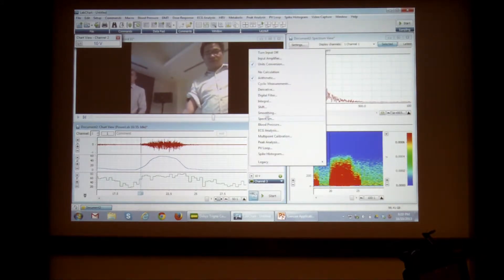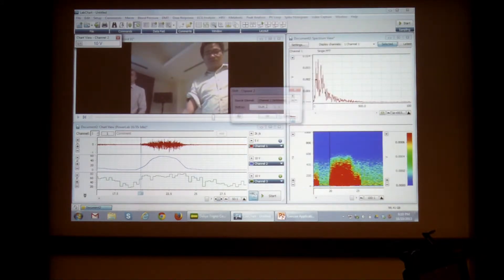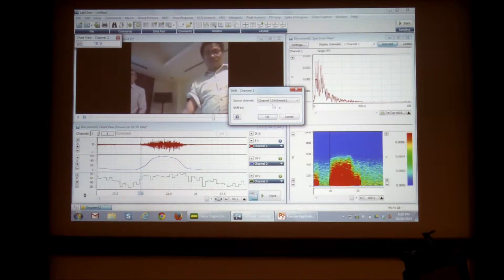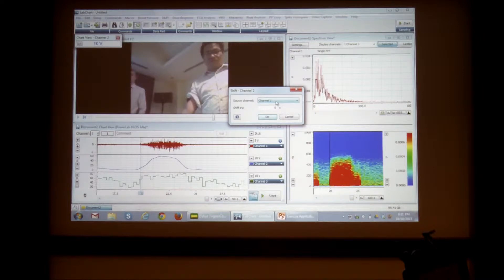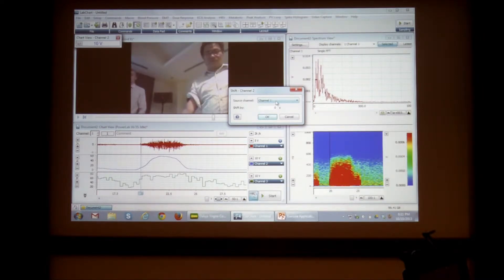And then you just use this shift function and shift the channel, so channel 1 by plus or minus point, so it's normally only like 0.1 seconds or something.